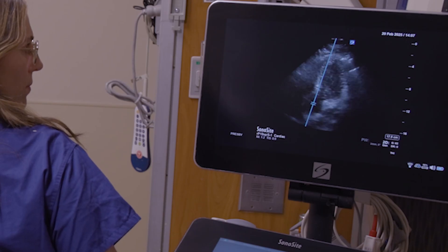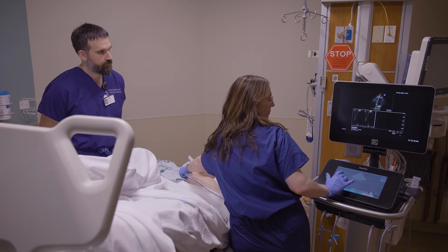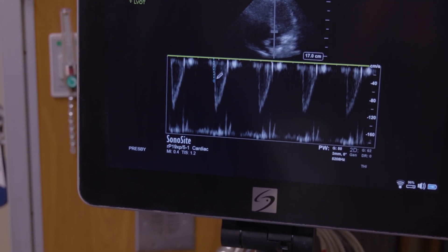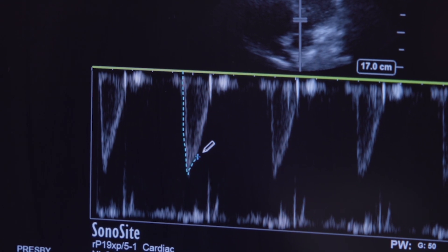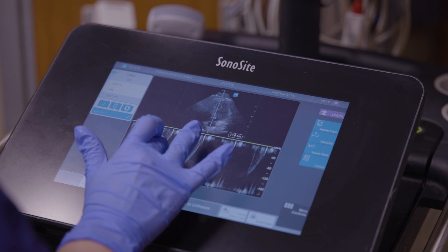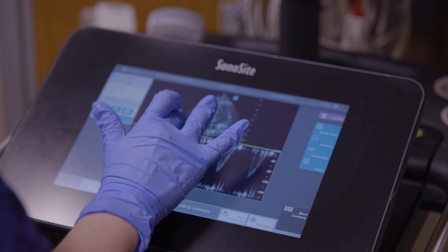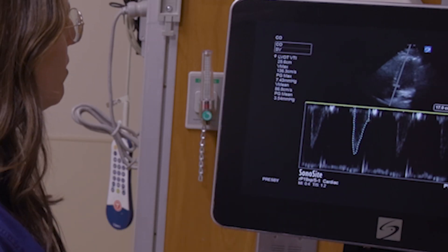Lauren is again getting that apical five-chamber view and repeating the same measurement process to obtain the LVOT VTI, which is a surrogate measurement for stroke volume. This will tell Lauren whether or not giving volume to the patient will augment their stroke volume. The post-passive-leg-raise LVOT VTI is 25.6.